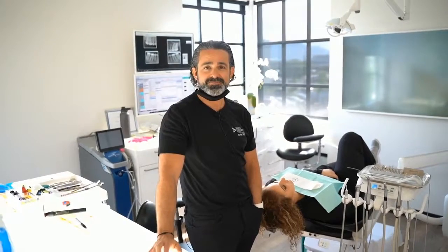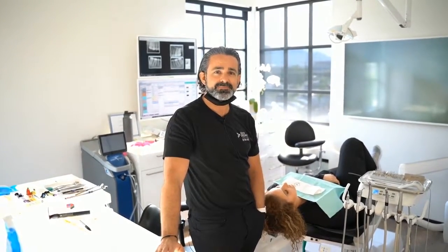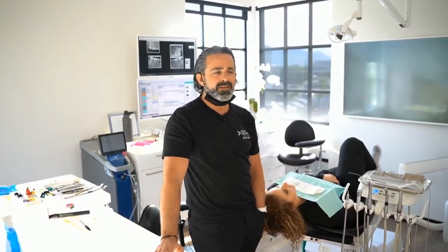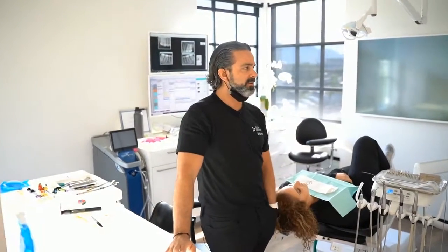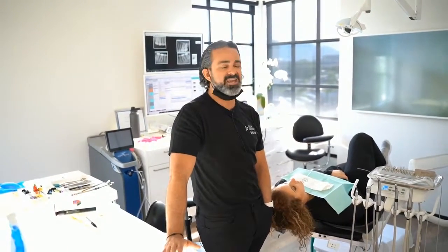Anything else? Any pitfalls to avoid, or any mistakes that you made on early microscopes that could help? Well, the microscopes have definitely gotten better. Believe it or not, having an arm that can balance and stay balanced speaks volumes to what's really going to frustrate you or not.